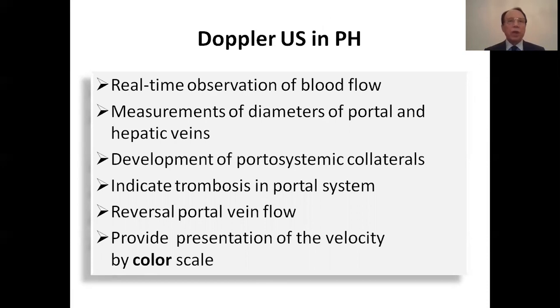Doppler ultrasound evaluates the patency of the portal vein system and reverse portal flow. Also, Doppler ultrasound can be used to follow up the patency of the transjugular intrahepatic portosystemic shunt and proved useful to save unnecessary invasive hemodynamic procedures.